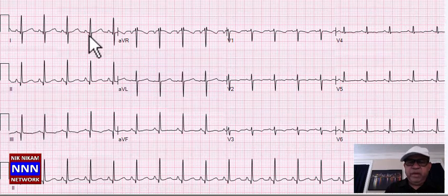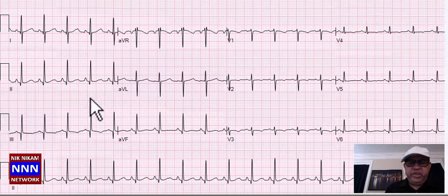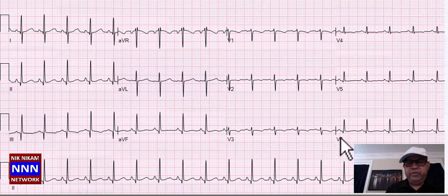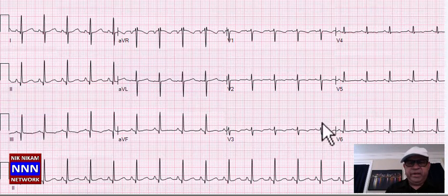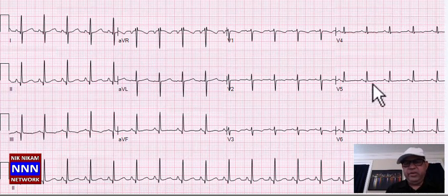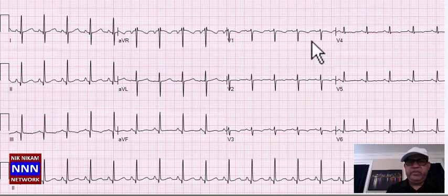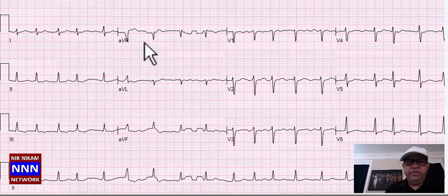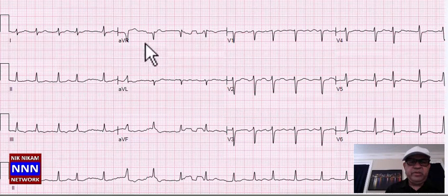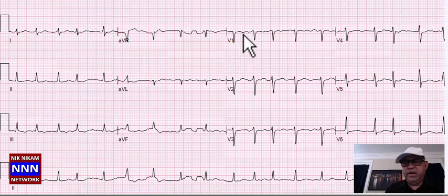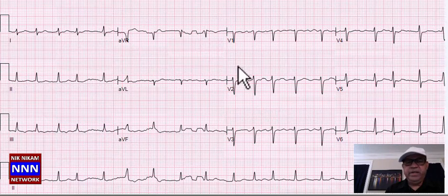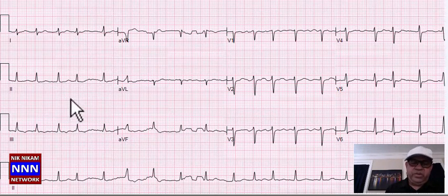Here's the next EKG — the rate is pretty fast at about 114. Sometimes we see ST-T changes related to rate, and when the rate slows down they may normalize. Nonetheless, this is sinus tachycardia with non-specific ST-T changes.